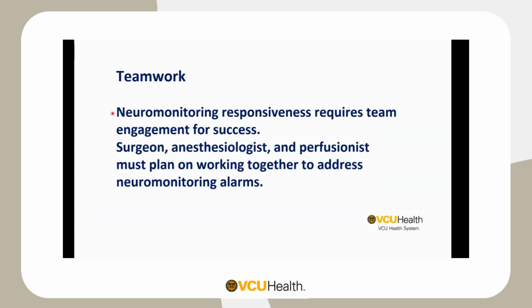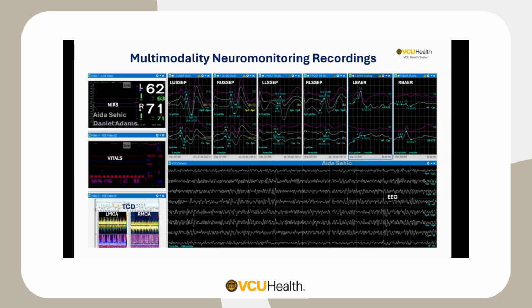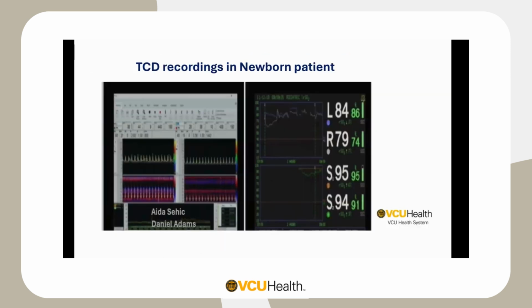Neuromonitoring responsiveness requires team engagement for success. The surgeon, anesthesiologist, and perfusionist must plan on working together to address neuromonitoring alarms. On this slide, I'm showing our multimodality recordings that include EEG, evoked potentials, near-infrared spectroscopy, transcranial Doppler, and vital signs from the anesthesia machine or system.